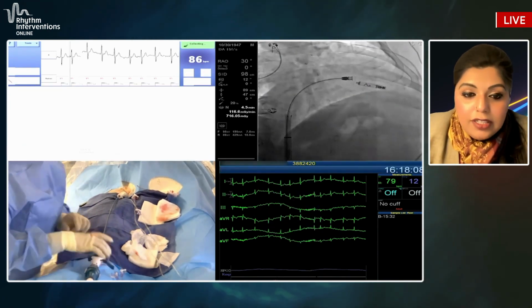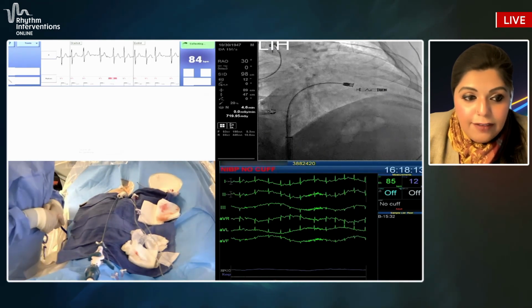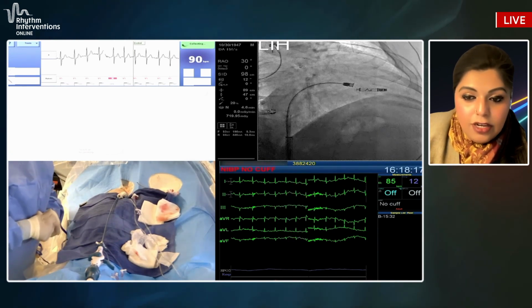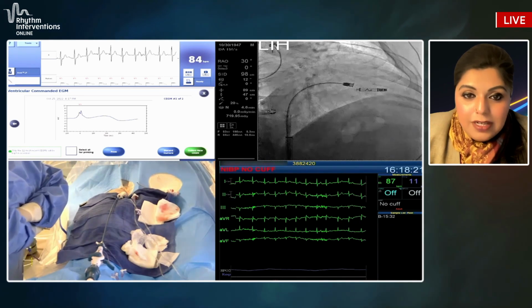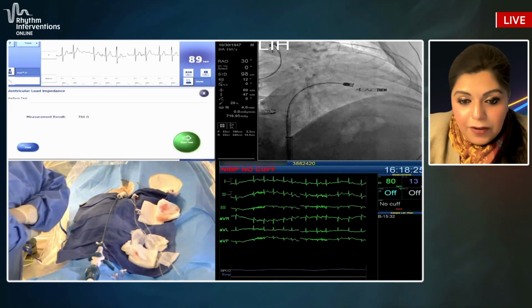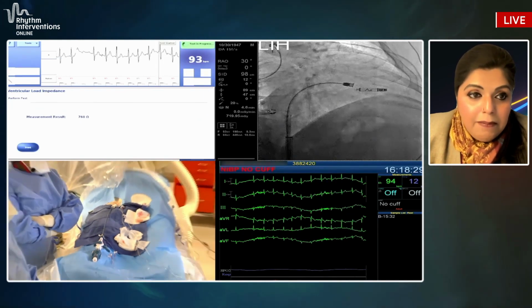And we're getting to do what's called the deflection test here. And what that is, I'll deflect on the lever here to about 30 to 45 degrees. And you're making sure you can do it 1 or 2 times. And you want to make sure that the helix position is stable when you're doing that deflection test. So once you're done with that deflection test, you are getting ready to do your post mapping now.